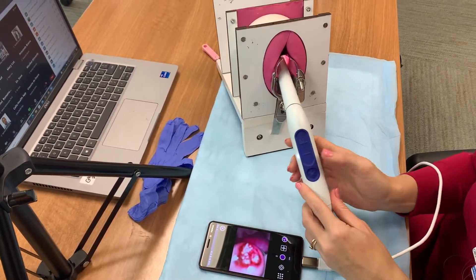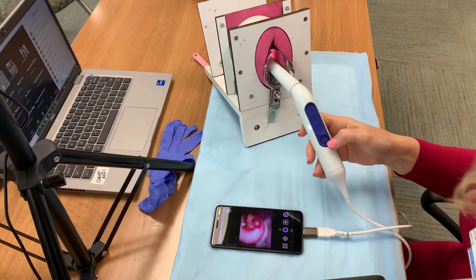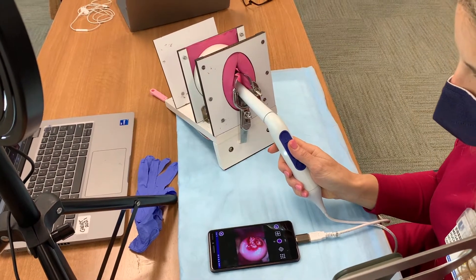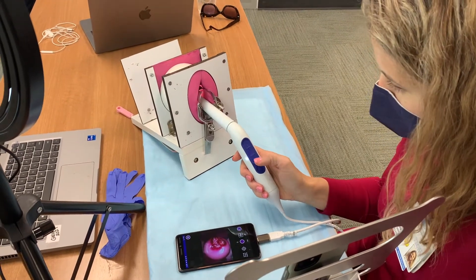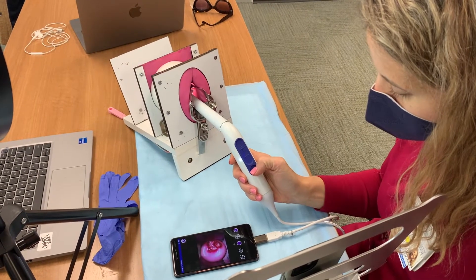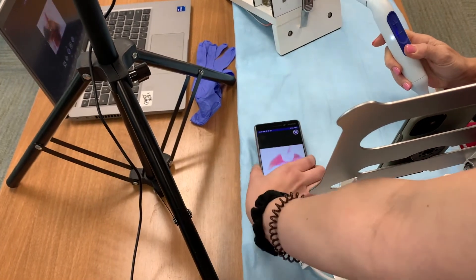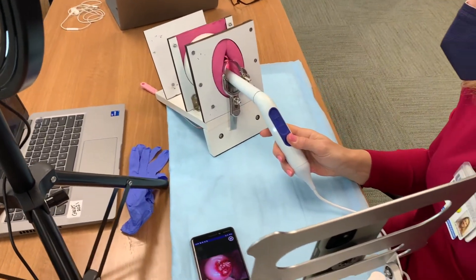As I enter it, I'm usually facing the patient — this angle is a bit awkward. It's really straightforward: you just move in to about three centimeters from the cervix until you get adequate focus. If you then want to examine the lesion with a green filter, you press the light button again. Going through the speculum with the light on, I move toward the cervix.